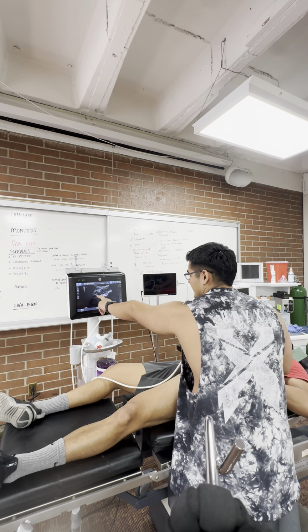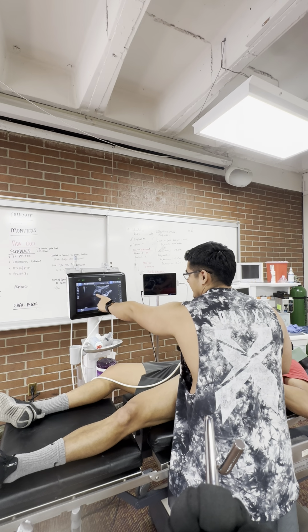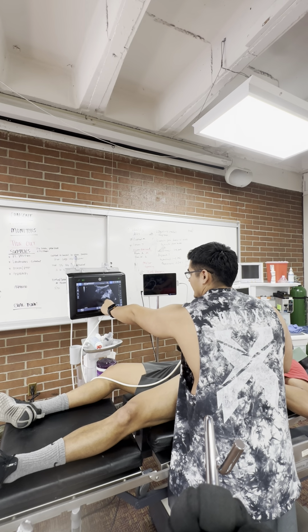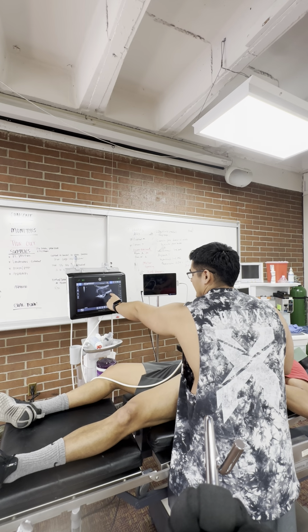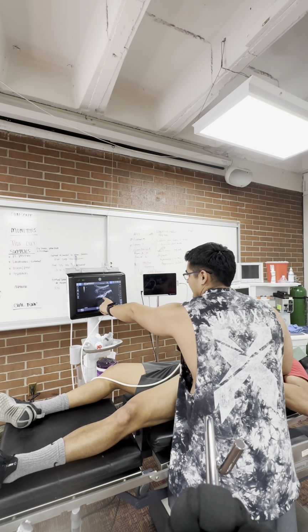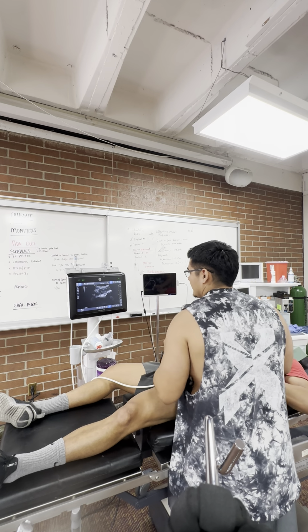We want to make sure we can locate the femoral artery. Femoral artery is pulsating here, and then you have the femoral nerve just lateral to that. And then here we have the AIIS, the iliopsoas muscle, and then you have the psoas tendon right here over the pubic ramus. So what you want to do is you want to do an in-plane approach.